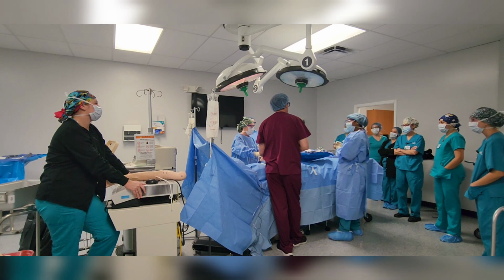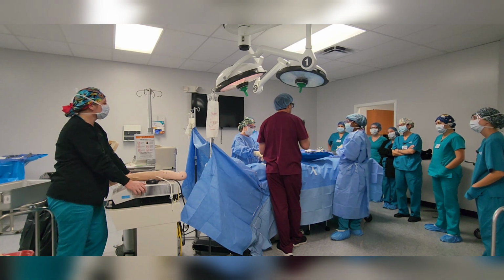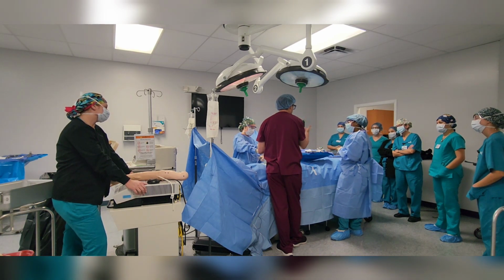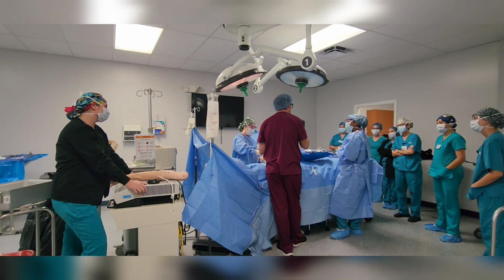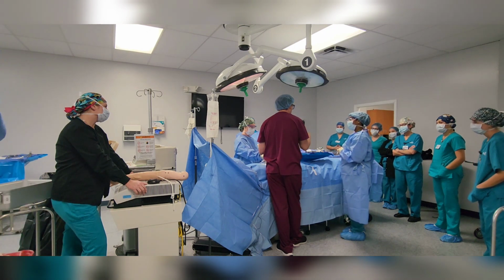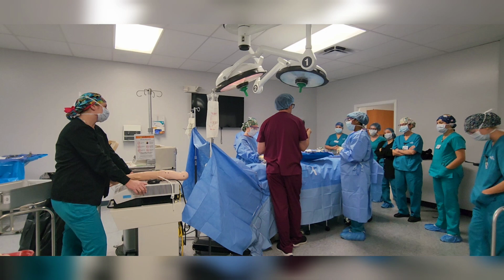No suture. We don't have time for everyone to go through it, but the one thing I want you to get out of this is clamp these down at least once. Make sure you're giving it firmly in their hand, unless it's a neurosurgeon. That's a little different because he's a little bit more delicate with areas. Vascular is another one. You want to be slow movements. Ortho, general surgeons, they want to make sure they see it in their hands, right?